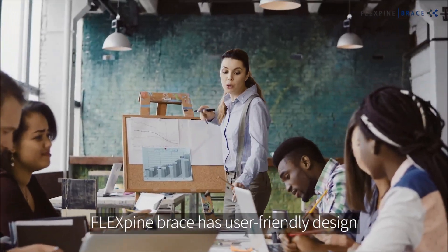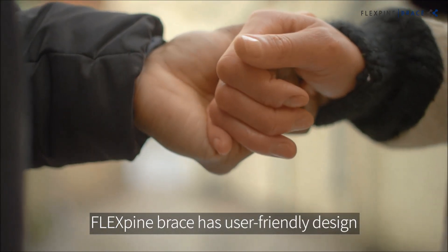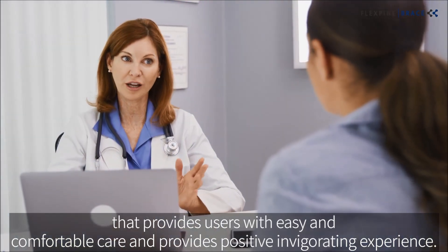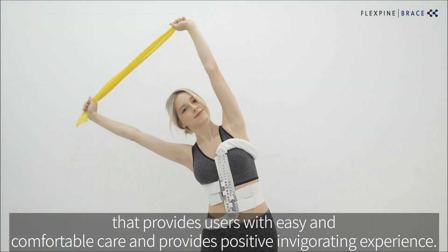FLEXpine brace has user-friendly design that provides users with easy and comfortable care and provides a positive, invigorating experience.